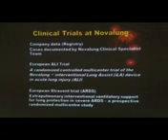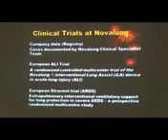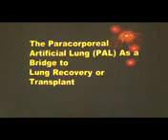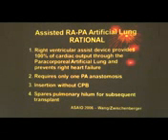In Toronto, there are different trials which have been done and they have found that this would be useful. So those patients whose lungs are still not recovering, who are waiting for either lung transplant or lung recovery, have something like a paracorporeal artificial lung device. Basically, it works on the principles of flow rate and takes care of the CO2 removal. The right ventricle assists it in that way. Most of the cardiac output goes to the paracorporeal lung and is able to remove the carbon dioxide.